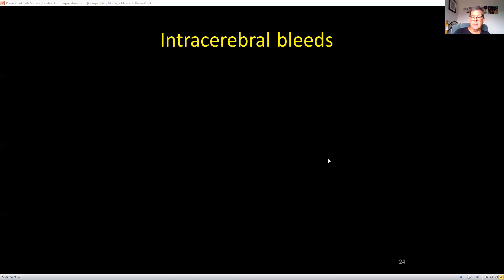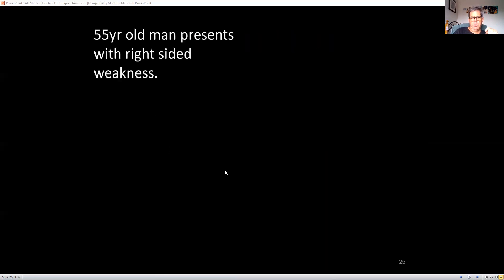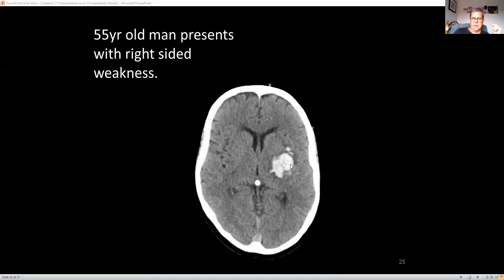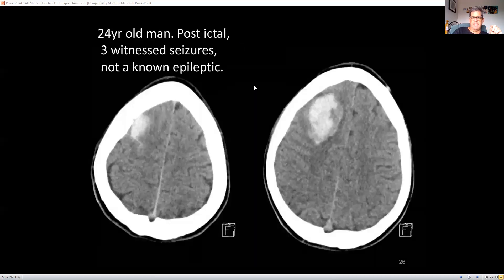Intracerebral bleeds are relatively easy to see because they're white — acute blood. Many are from hypertensive hemorrhage or AV malformations; sometimes you'll see bleeding into a neoplasm. We most commonly see hypertensive bleeds. Here's a 55-year-old with right-sided weakness — looking at the left side of the brain, there's a large thalamic bleed of about three by three centimetres, quite deep inside. A 24-year-old with new-onset seizures has a bleeding area that doesn't look like the typical hypertensive bleed location — this is in fact from an AV malformation.